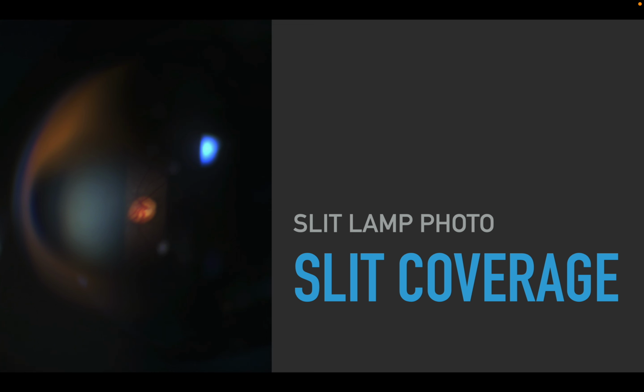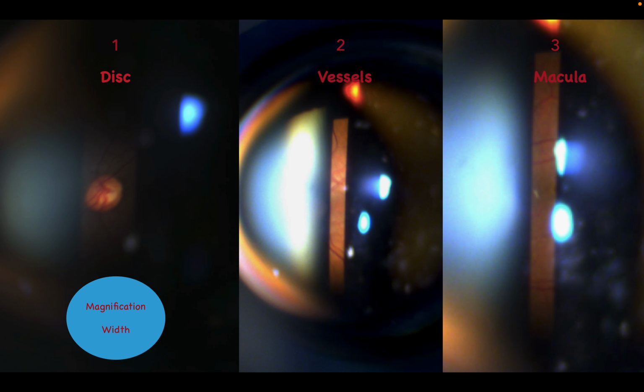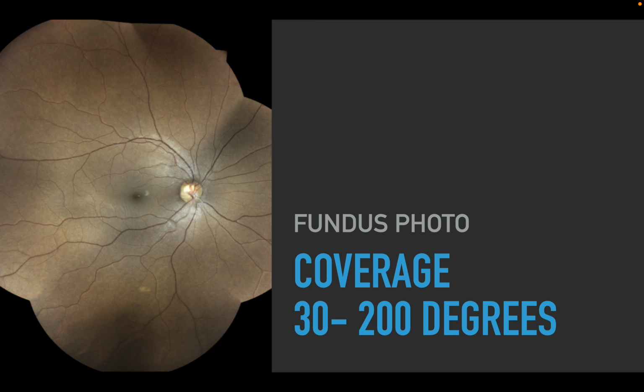The slit lamp coverage is a vertical slit which covers a small portion, with or without dilatation. But the area which is covered is a very small portion. You can use magnification to see the details of the disc and the peripapillary area. The next area seen is the blood vessels and also the macula. But the magnification and the width of the examination are very limited.